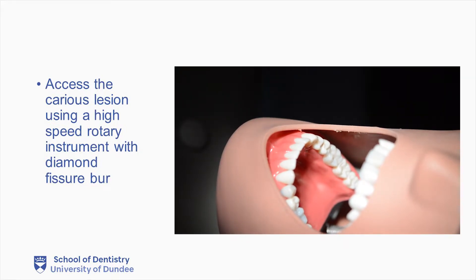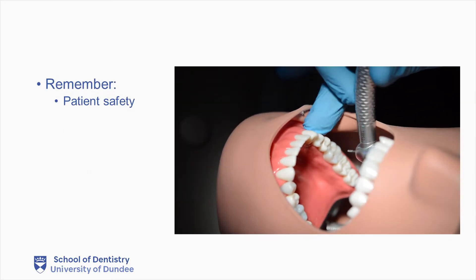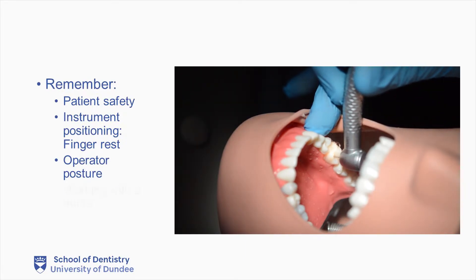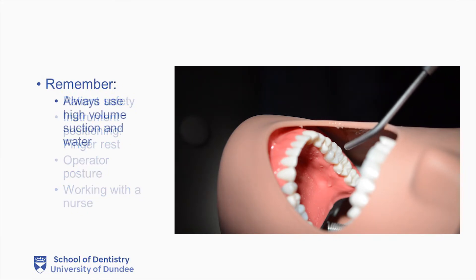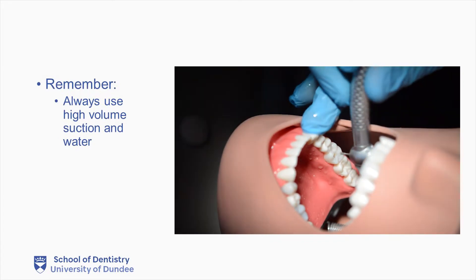Access the caries lesion using a high-speed rotary instrument with a diamond fisher burr. Remember, when using high-speed rotary instruments, patient safety is paramount. We also must be wary of how we position our instruments and ensure that we have a good finger rest. Our posture is also something that we need to consider, as we will be performing these procedures multiple times a day throughout our working lives. And be mindful that you will be working with a nurse, and so the ergonomics of this environment must be considered. Also remember that we must always use high-volume suction and sufficient irrigation to keep our rotary instruments cool when performing these procedures.